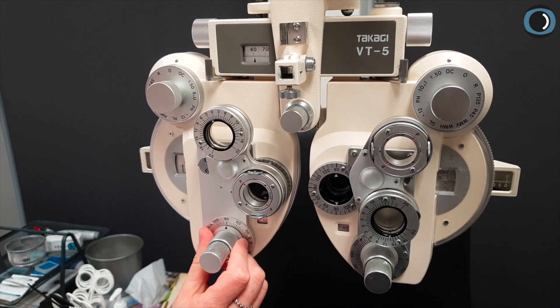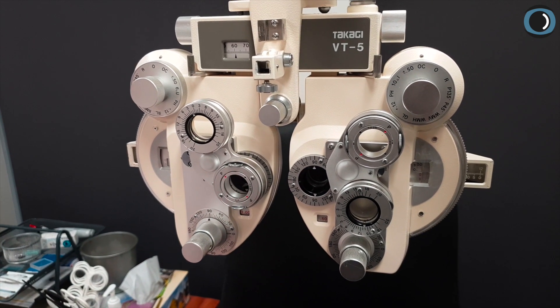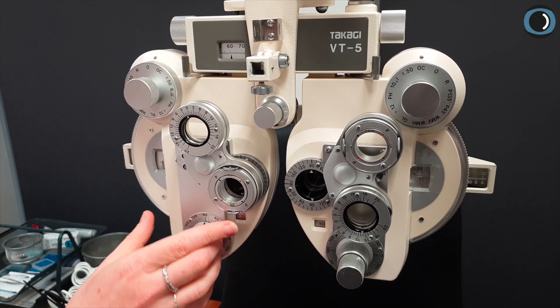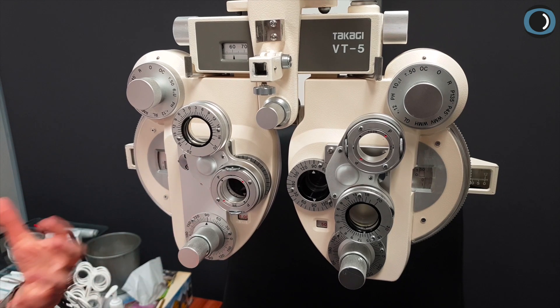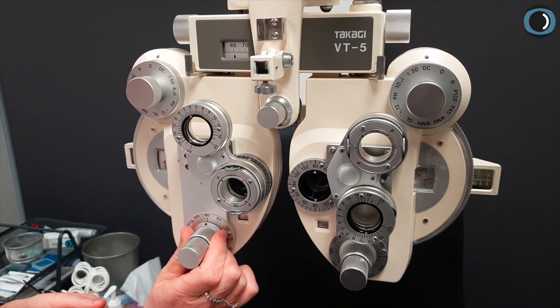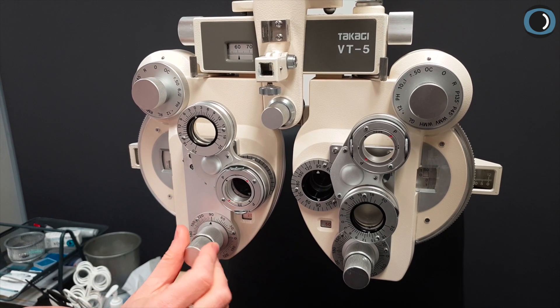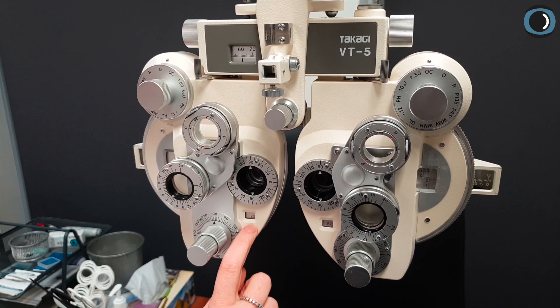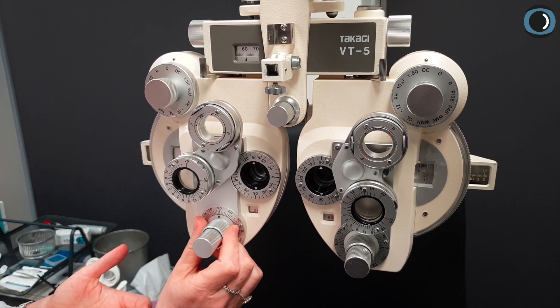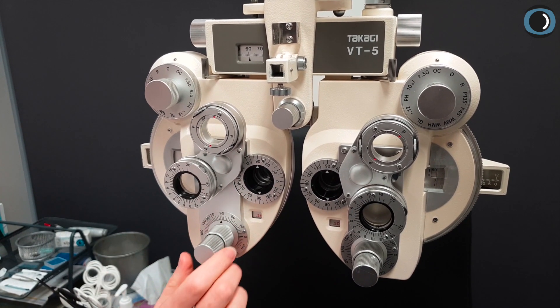Once we get to 90, there are three possible answers: the patient could say they prefer this one, this one, or they're the same. We can reassure them that it's okay — they might look the same, and we can make small adjustments from there. Keep in mind that on a 025 cylinder, the tolerance when making a pair of spectacles is several degrees, so we really don't need to worry about a couple of degrees with a 025 cylinder. This is obviously much more important with higher cylinders.